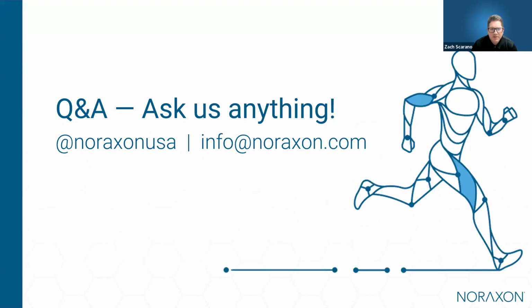Are there specific places to put the device on the muscles for optimal data retrieval? Great question. This is getting into more of how to use EMG. I would encourage you all, if you do have these types of questions, to go on our website and look into our knowledge base.